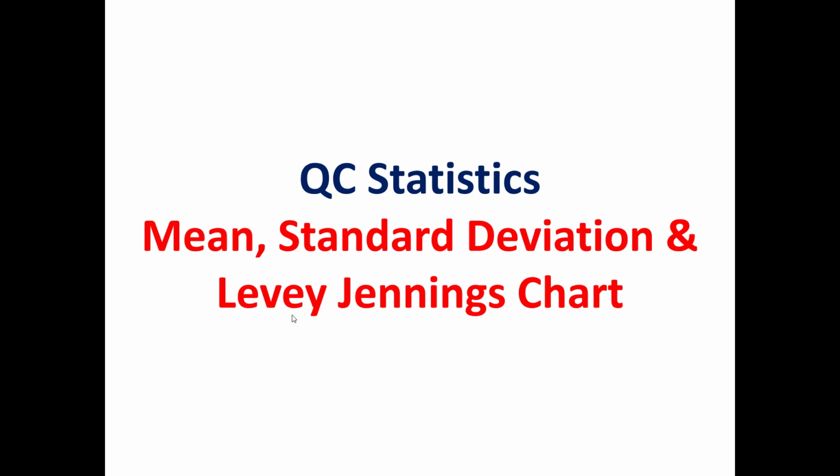In order to make the analysis, first of all, we should have a definition for the mean and the standard deviations, and how to use them in Levey-Jennings charts and the Westgard rules in order to decide what type of error we have and how we can fix this error. As we will see, we will have two types of errors. We have a systematic error and we have a random error, and each one will be related to a specific reason or some causes.